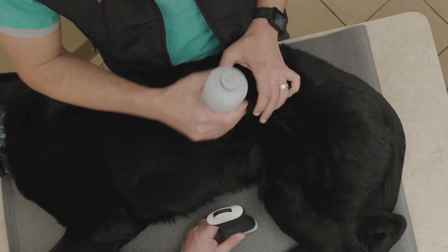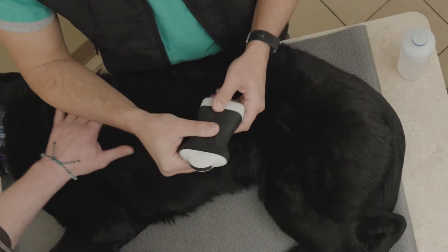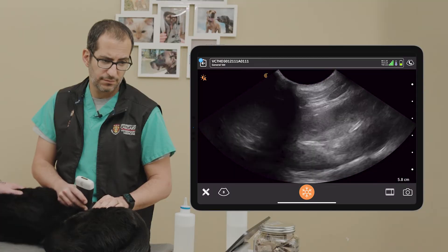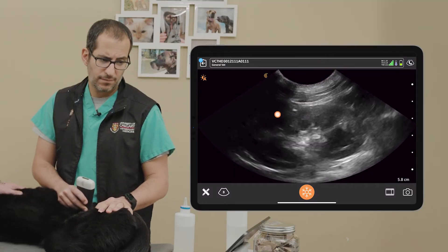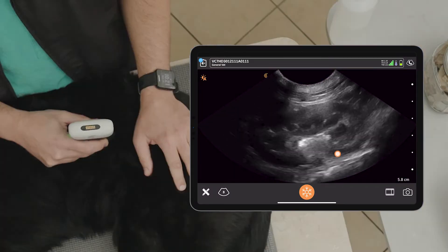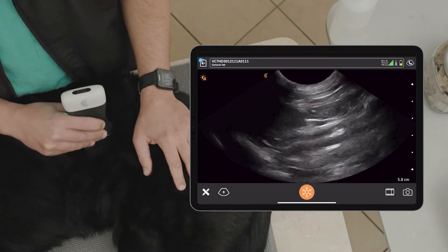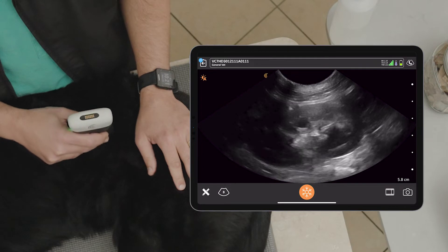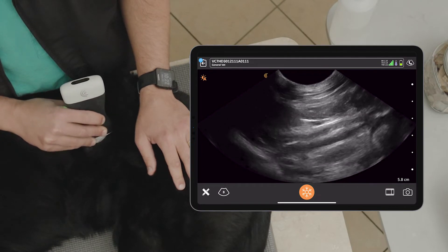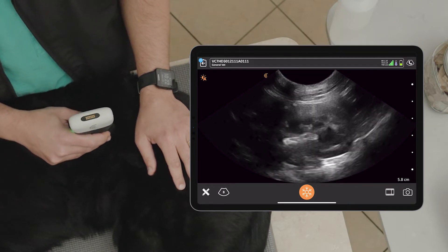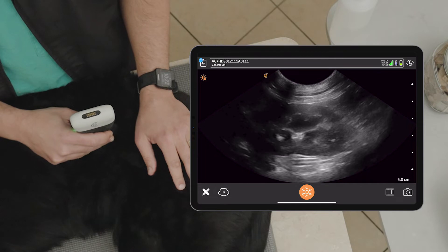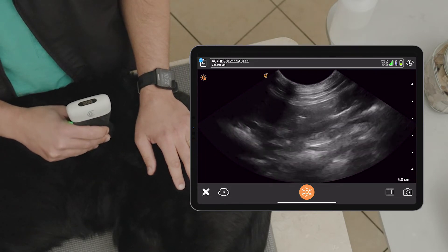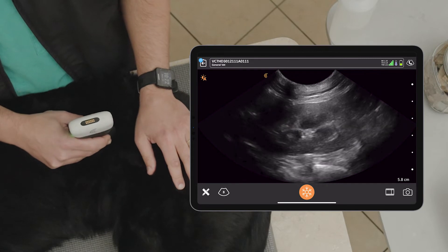So Serge is going to do that for our left paralumbar site, and he's going to pop the probe in with the marker towards the head — and there's our kidney in long axis. The questions we're going to ask and answer with that probe in long axis: we're going to fan off one side, fan off the other side, make sure we have no free fluid in the abdomen at this location, and we're also going to look for retroperitoneal free fluid at this site as well — no retroperitoneal injury or fluid accumulating in the retroperitoneal or abdominal space.